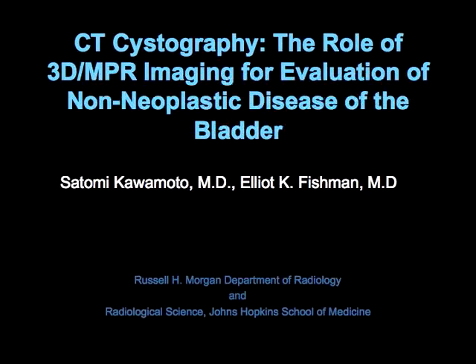Hi, this is Elliot Fishman, and this talk will be on a very interesting topic, something that probably most of you aren't doing, something we hardly ever did, but now we do a lot of, and that kind of sounds complicated, but it's CT cystography. And this is actually based on an exhibit we had at RSNA 2007, and hopefully you'll see this in press in the near future.